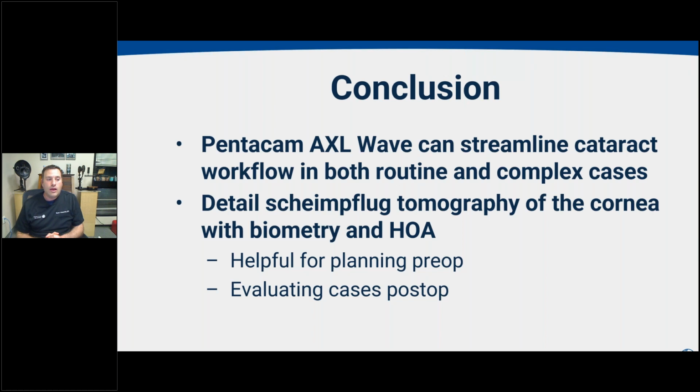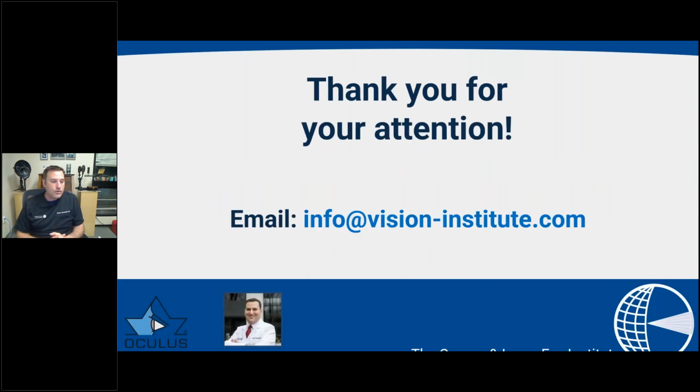So it really helps you best analyze what is best from an IOL platform for your patient, how to counsel your patient about their diagnosis and the surgical plan, and also how to evaluate some of your cases post-op, either because you just want to confirm placement of the lens, or the patient may have visual complaints, and really be able to identify those and confidently treat them for excellent visual results. So with that, I will turn things back to Bill, and thank you for your attention.